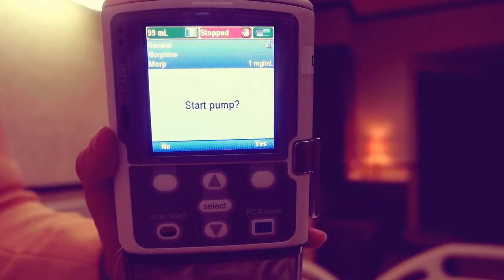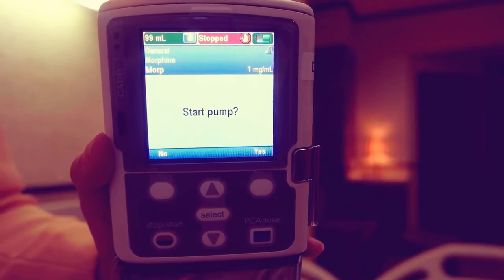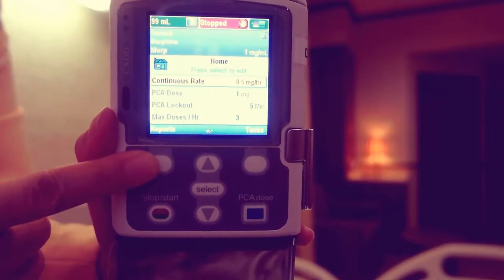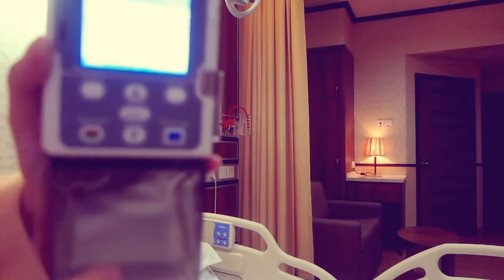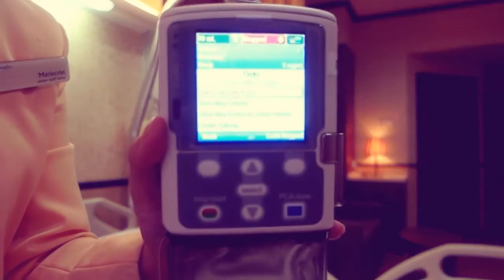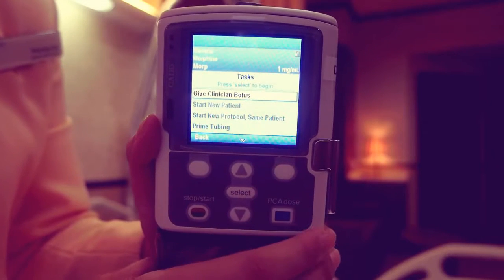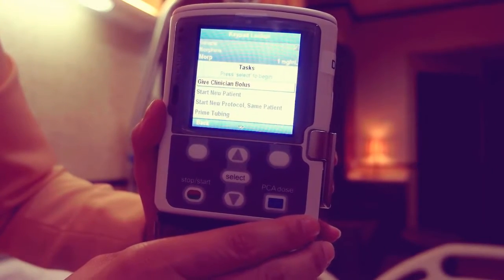If you are not starting the pump immediately, press no when start pump appears. Lock the keypad by pressing the right soft key, then lock keypad. Ensure that the cassette is also locked by turning the cassette clockwise to the locked position.